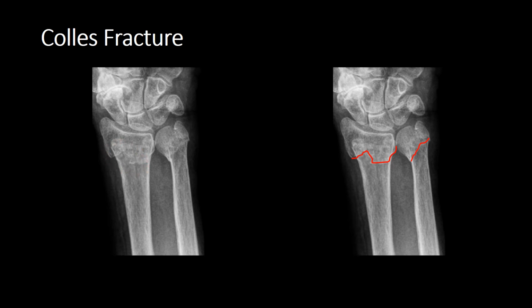distal radial metaphysis. Now remember, the long tubular portion of long bones or miniature long bones is the diaphysis. In an adult, the flared portion all the way to the end of the bone is the metaphysis. In a child, you have the diaphysis, which is the long tubular portion. Then you have the flared portion, which is the metaphysis.